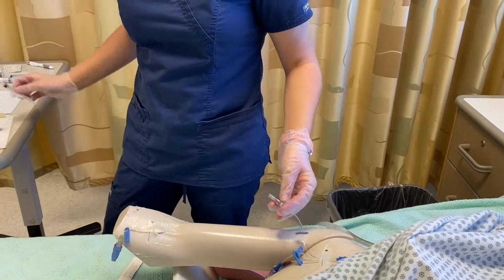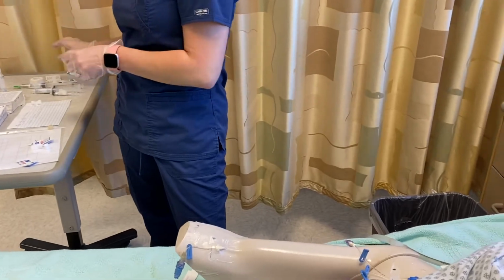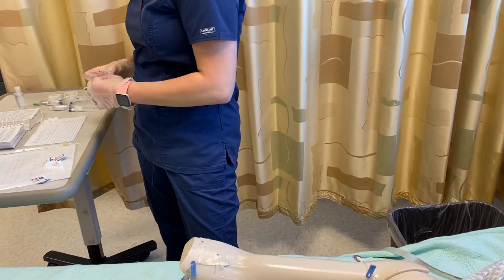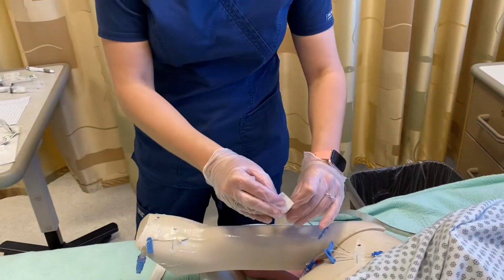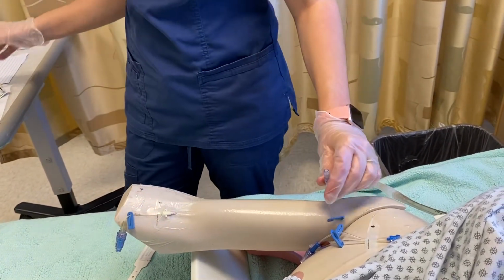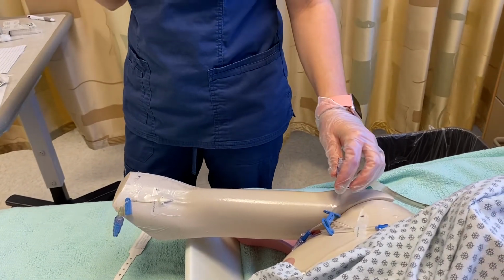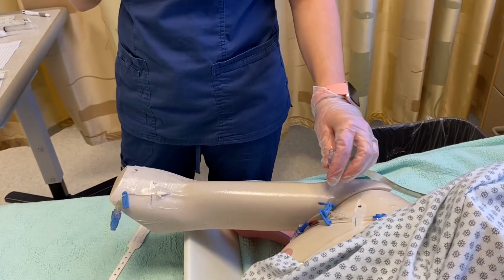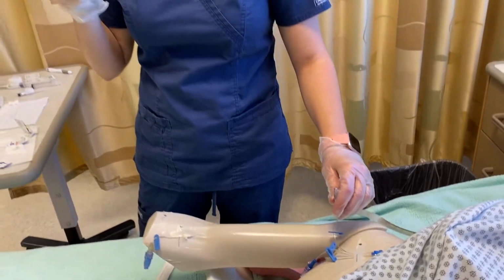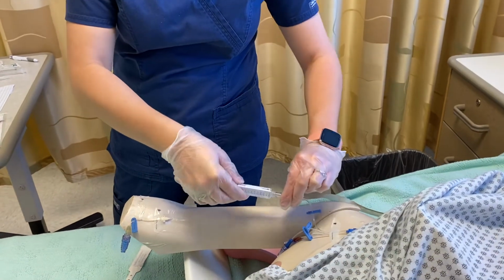Take that off again. Grab another alcohol swab. Clean that. Grab another saline flush. Expiration date, check, we're good. Remove any air. Attach.